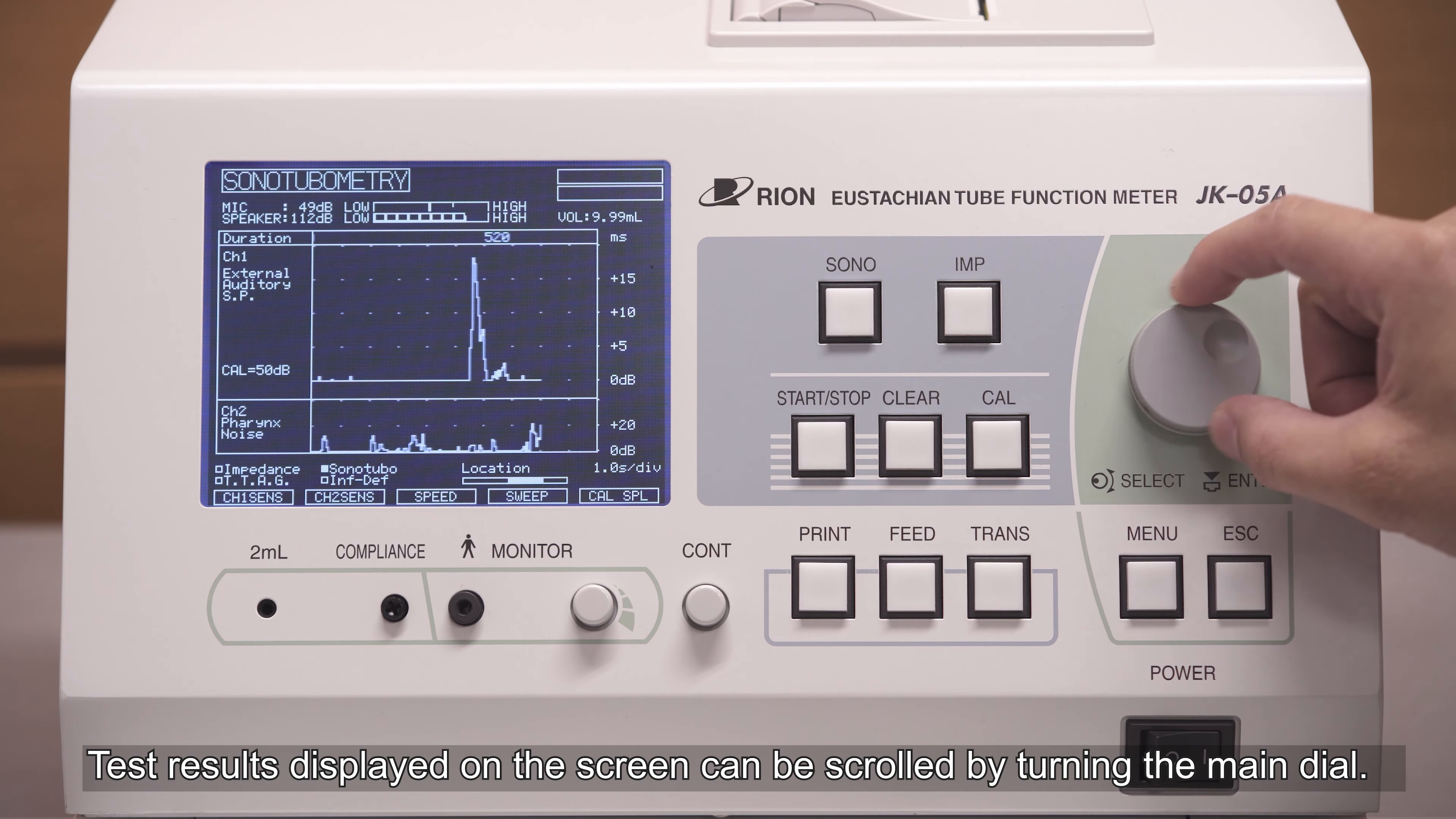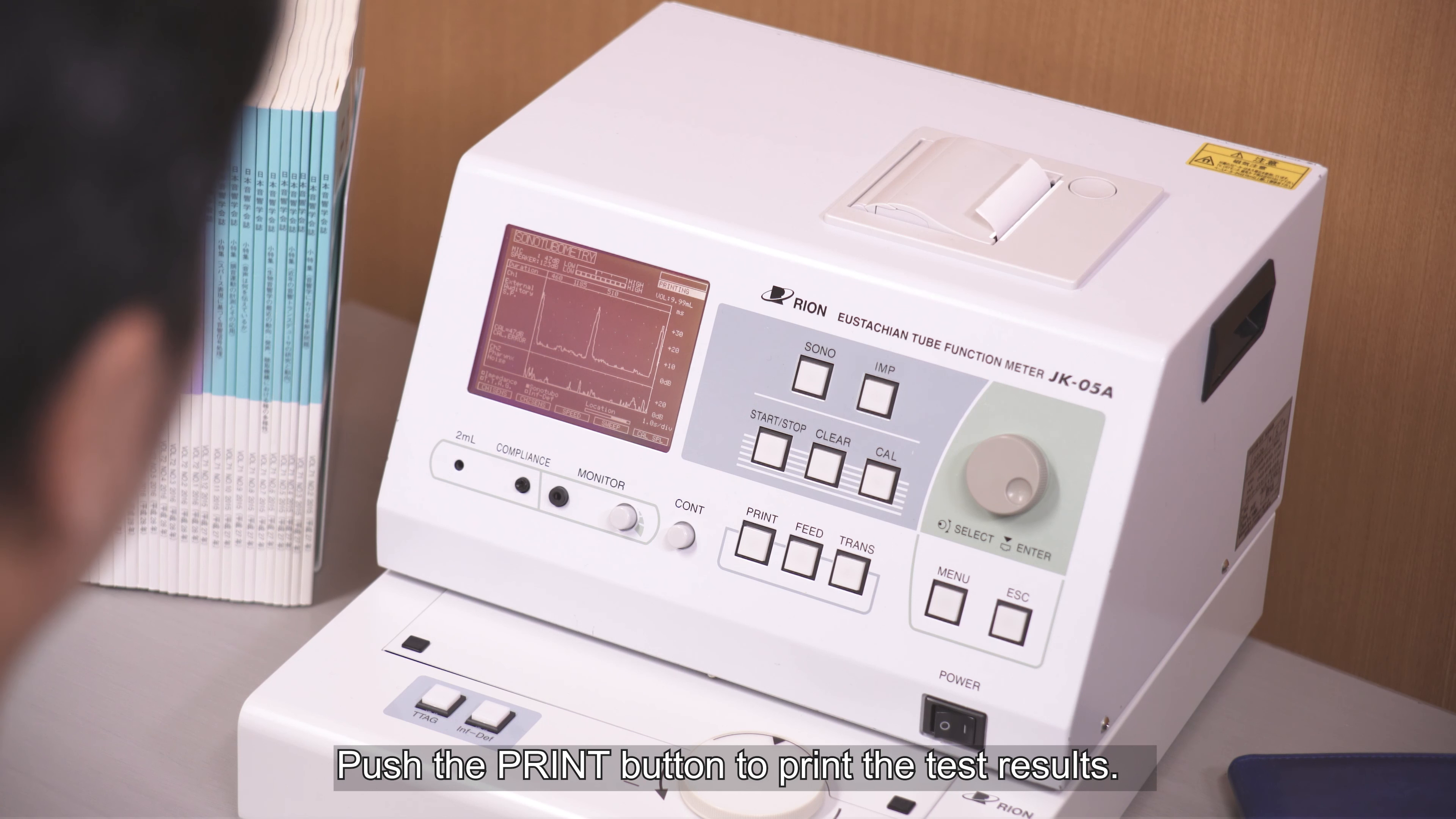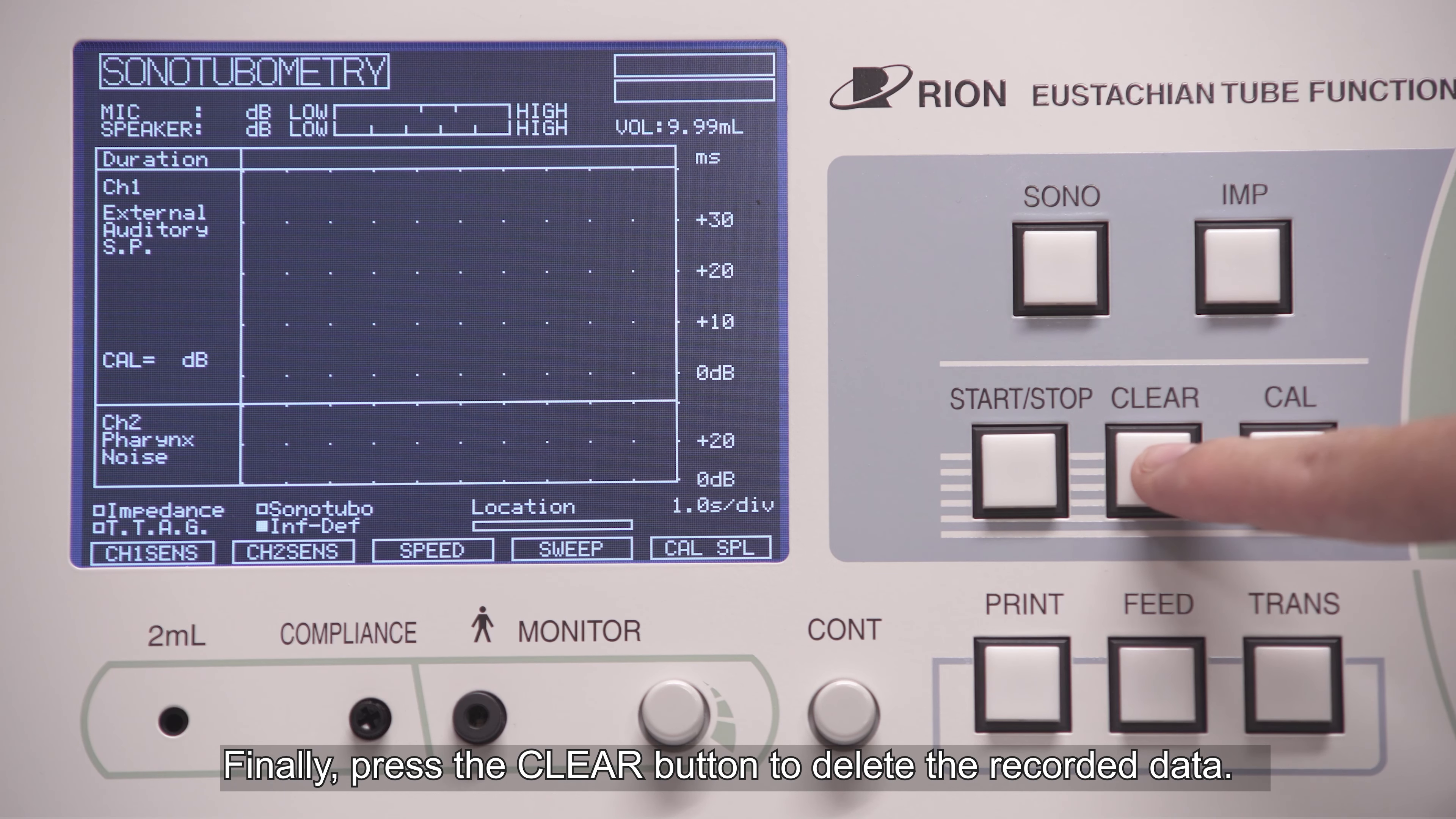Test results displayed on the screen can be scrolled by turning the main dial. Push the print button to print the test results. Finally, press the clear button to delete the recorded data.